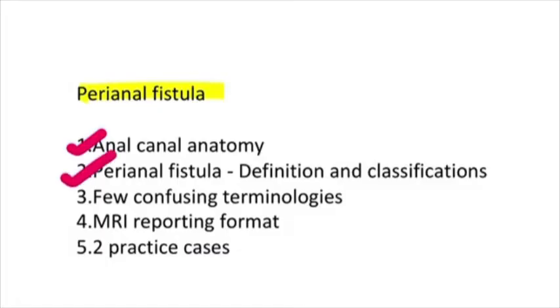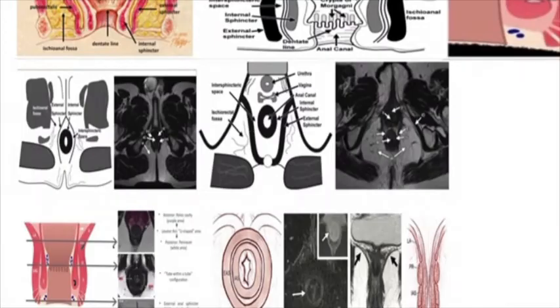Then we will discuss a few confusing terminologies, such as the internal opening not visualized and the external opening not visualized. And then we will look at how to report these cases, the MRI reporting format. And at last we will be practicing 2 cases. Okay, so let's start.